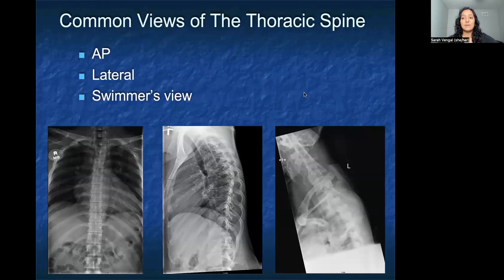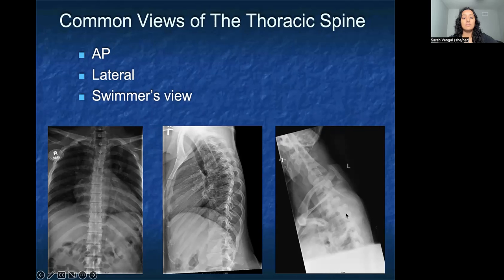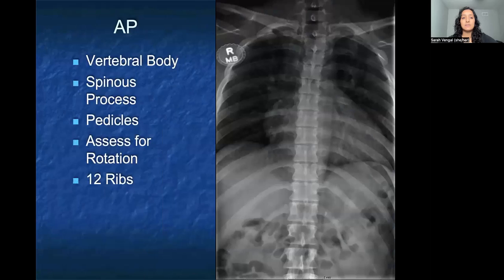When we think about the thoracic spine, the three most commonly obtained views are the AP, which is here on the left, the lateral, which is in the center, and the swimmer's view, which you can see on the right. We're going to take the time to delve into those in depth.